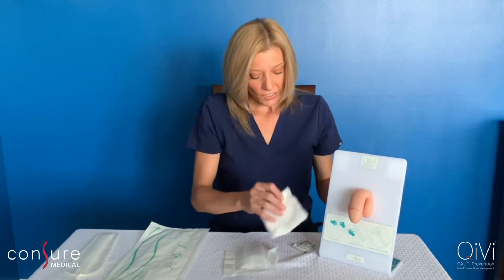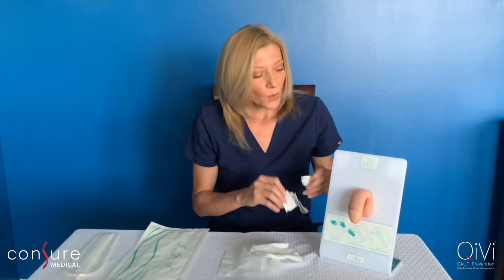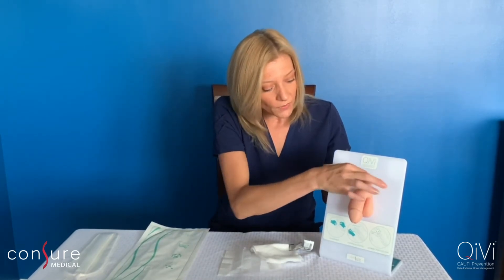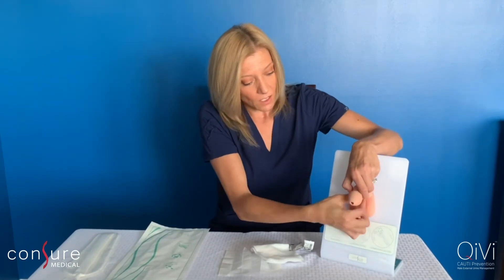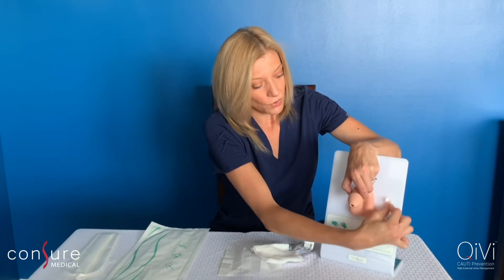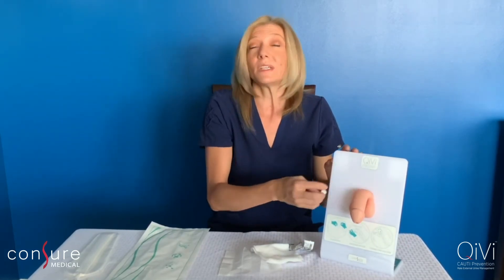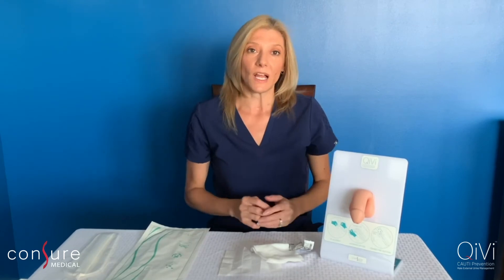Also, if you have any skin prep readily available, we recommend using some of it around the base of the penis — it'll help you get a great adhesion. When you're using skin prep, you do want to make sure that the skin prep is allowed to be completely dry before applying the device.